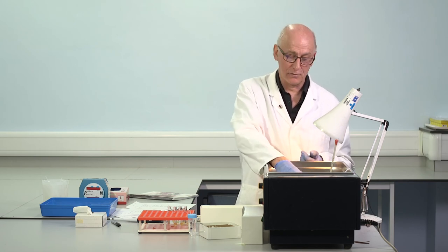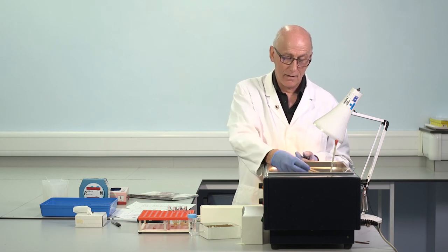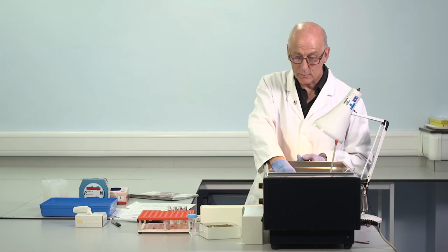And the same problem occurs with factor XI. Mild deficiency masked by acute phase response, high level of factor VIII. So again, we have to be careful not to overinterpret APTT.